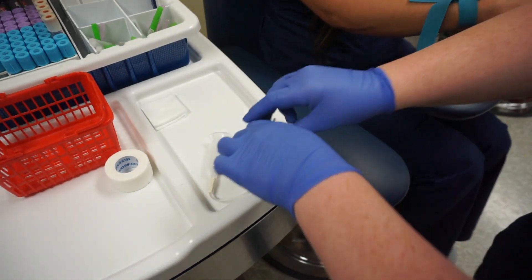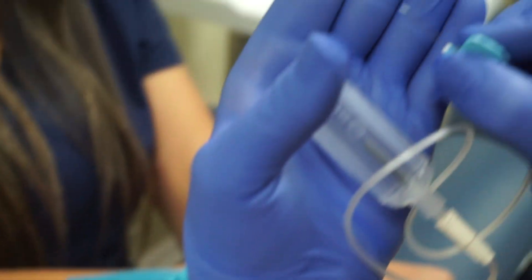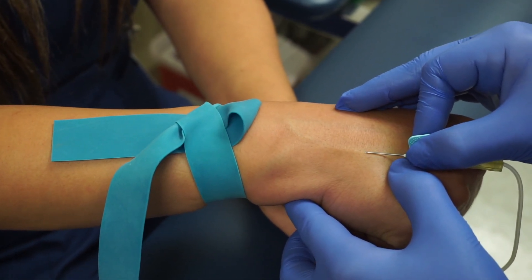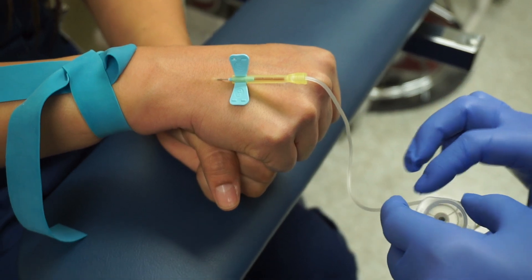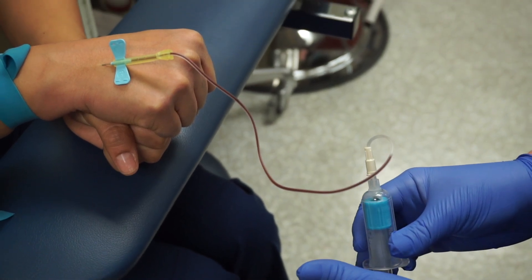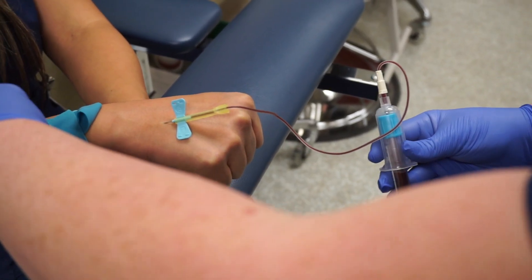Now that I've given it time, always make sure the bevel is facing upwards. I'm going to take the plastic off — the bevel is really small but you want it facing upwards the whole time. You're going to anchor and go in. When you get it, you'll see a flash of blood just like that. You can let go of the butterfly because the wings will sit down on the hand. Put your tube in and it will start coming down and filling up, just like that.